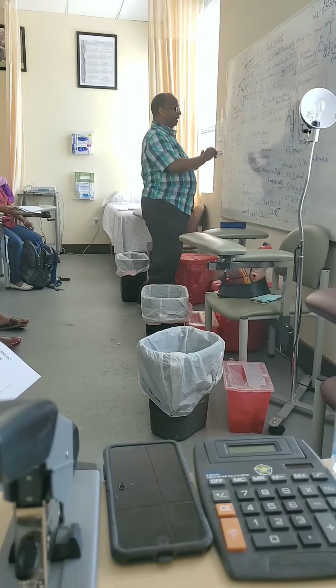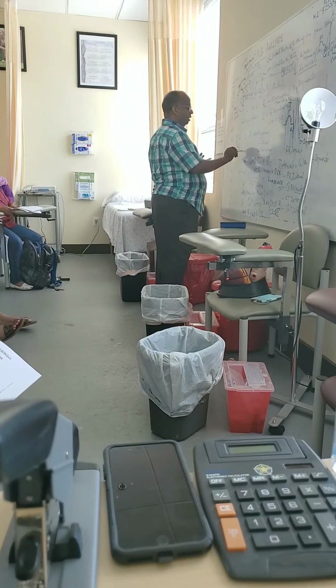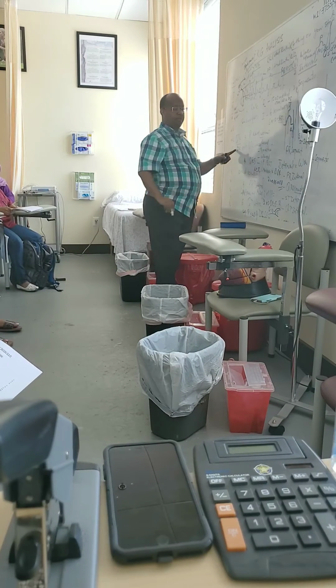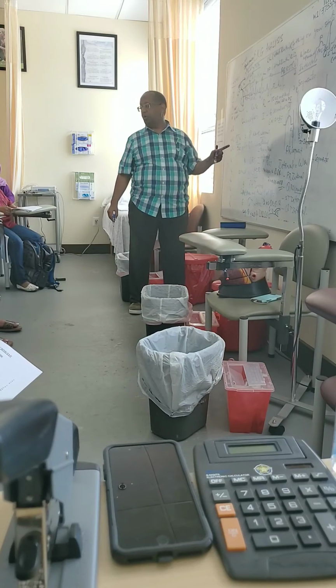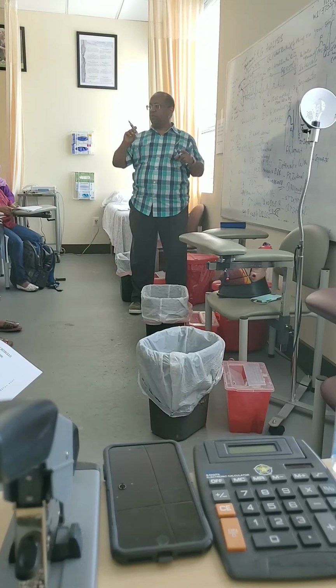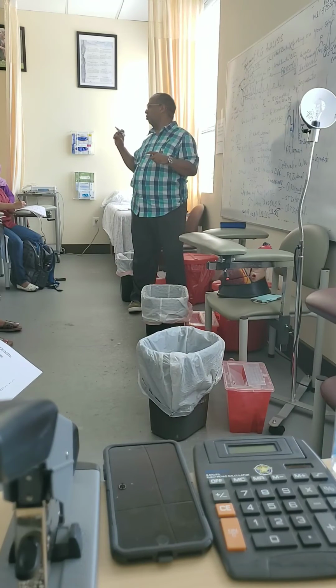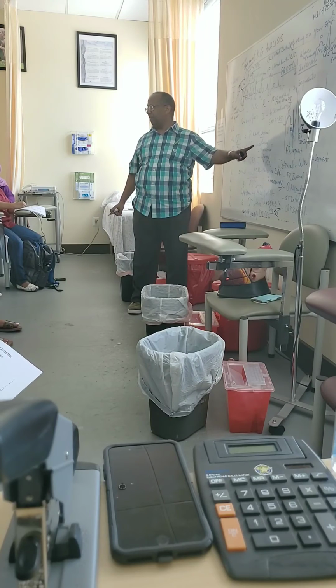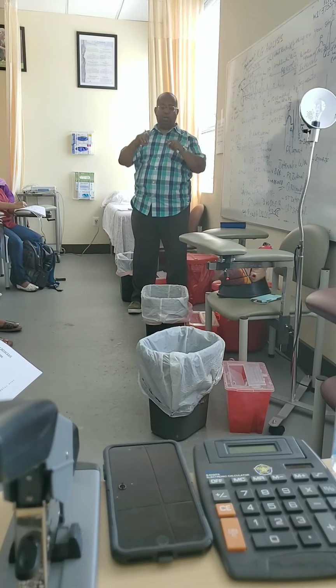This is called Bazett's QTc interval. Bazett is the person who devised this formula. So you need to go online and find the Bazett's QTc interval calculator.